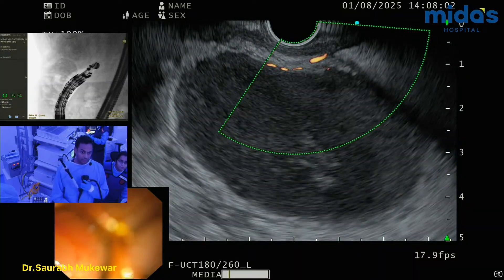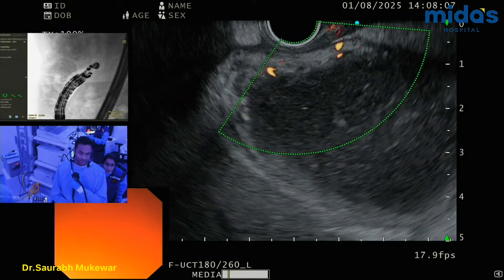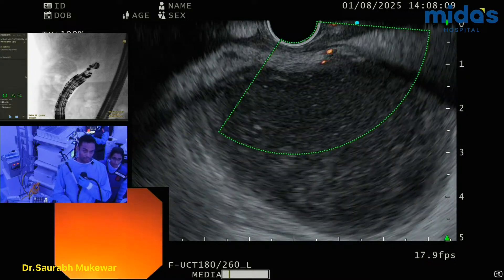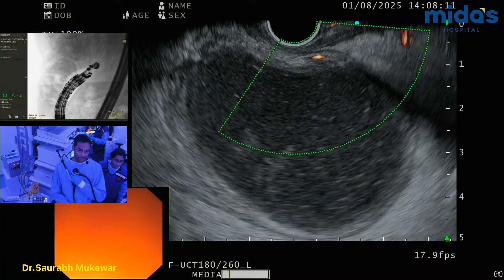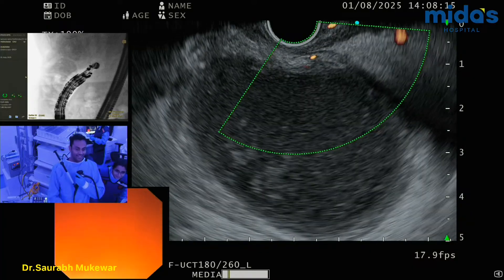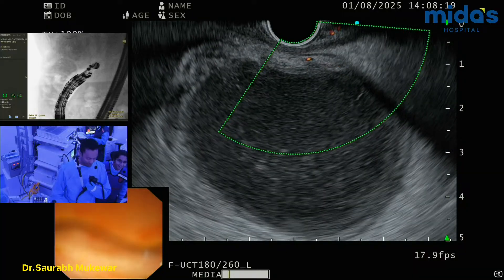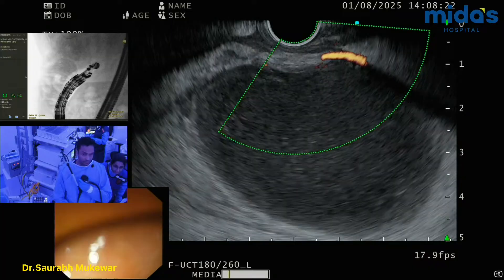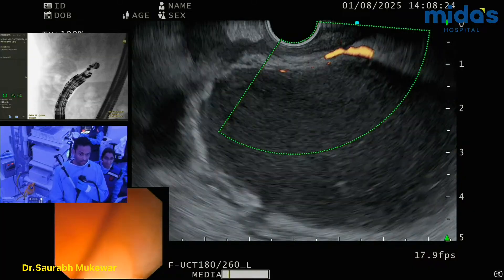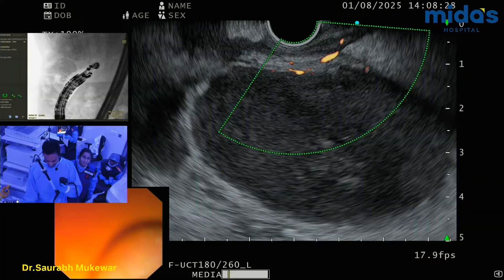Now here we don't have a challenge of distension — absolutely adequately distended area. The problem is vessels. We have to find a good avascular part. Unfortunately, as it happens, the vessel has to be in your perfect position. So life is not easy — it's going to make it harder for me. The other option sometimes is to get the patient's position changed, if that helps. Try Doppler here.